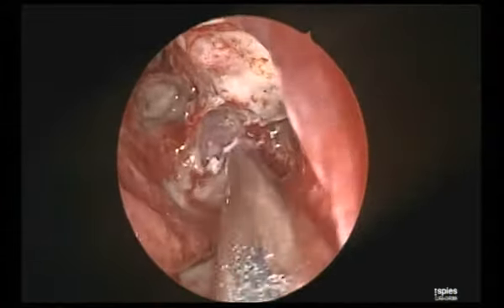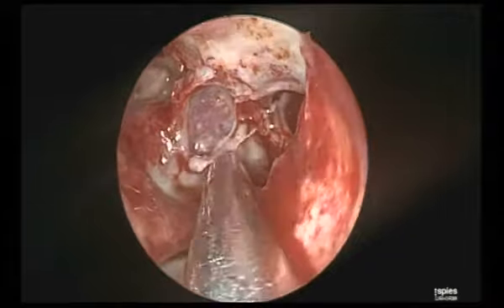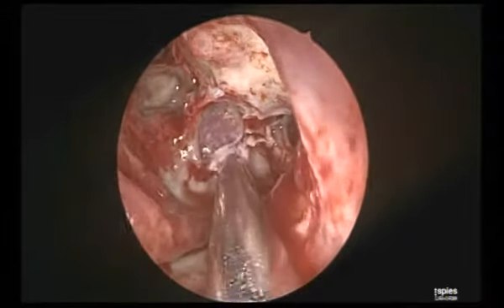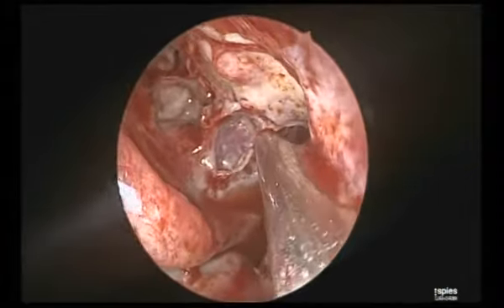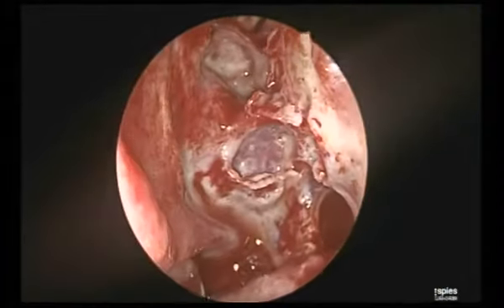Can you see that? Yes, very nicely. थोड़ा कैमरा को सीधा करो. Yeah. Some irrigation work is being sorted out. Yes. Now you see.